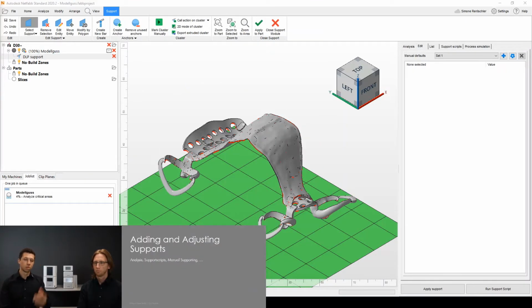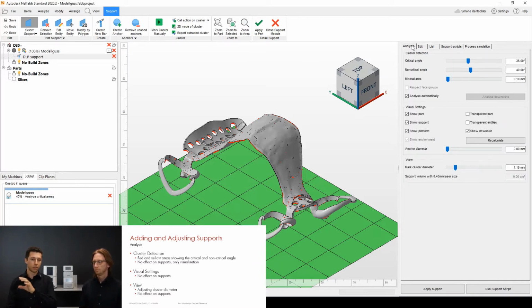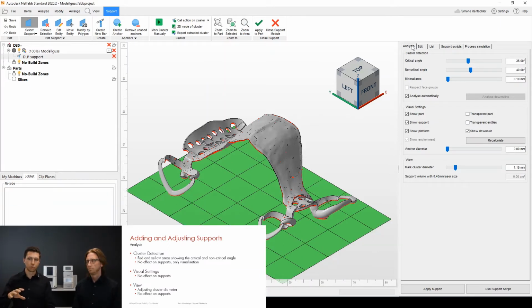So now I'm in the support generator, but how do I now add and adjust supports, and what's it all about? Because you now can see a totally different window or totally different buttons than usually you can see in the normal NetFab main screen. So we will have a look at the most important ones for now. Let me start with the Analysis tab. You can see it on the top right. I select Analysis, and you will now see only visualizations of the complete support generator.